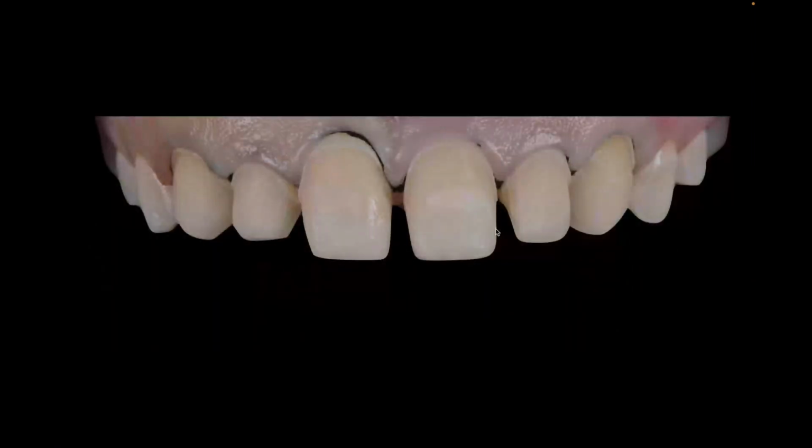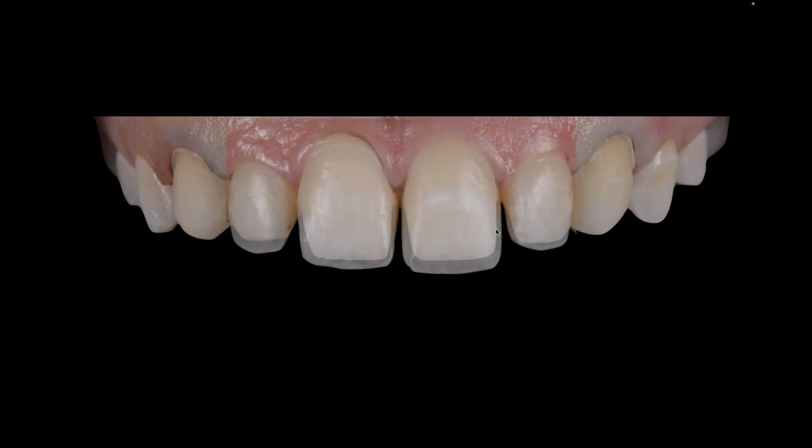Okay, in her case, we always want to try to keep a minimal reduction if we can. So let's look at the finalized preparations. And I'm going to show you an overlap of where her teeth were before this. So here's kind of the beauty of it, where we didn't need to take away much tooth structure from the 2-1 or the number 9.